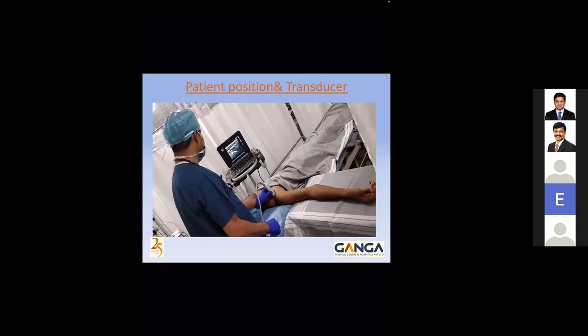How do you position the patient, and how do you place the transducer and ultrasound machine? Ideally, the patient should be placed in supine position, with the head turned towards the opposite side. The ipsilateral arm should be abducted, and the operator should stand at the head end of the patient. Ideally, we require a high frequency linear probe. As it is a superficial structure, a high frequency linear probe will be enough, and the ultrasound machine screen should be on the opposite side.